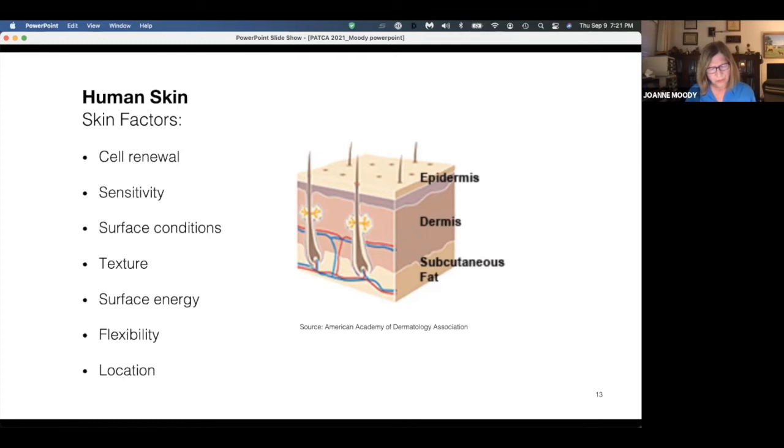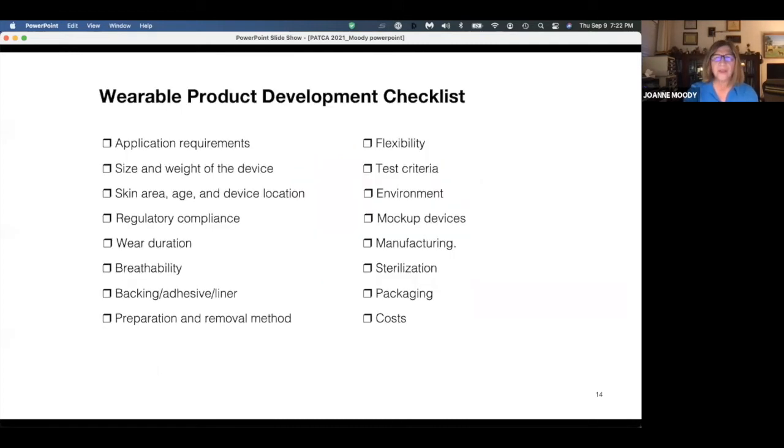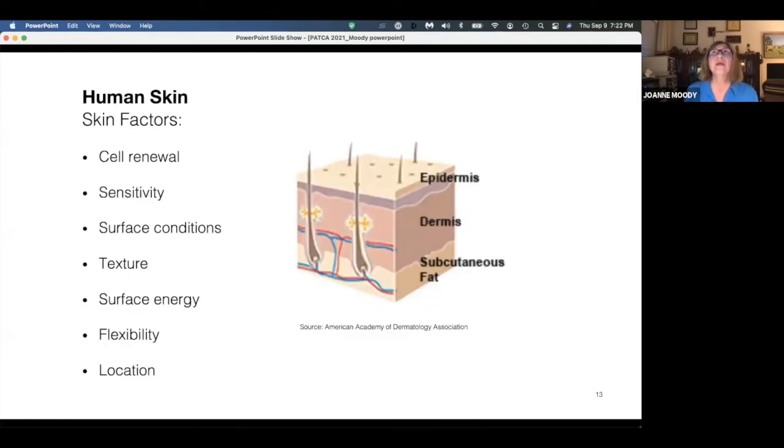The surface conditions of the skin are critical when you're using it as your substrate, because you've got skin that can be oily, dry, textured, it can have hair on it. And so you have quite a bit of variation in your skin surface and texture. Then one of the factors that I'll go into in depth just in a moment will be the surface energy of the skin. So when we work with adhesion to substrates, what we do is we look at surface energy, and I'll go, it looks like it's a couple of slides down, where you know that bonding to, like, Teflon is very difficult. Well, bonding to skin is also very difficult.